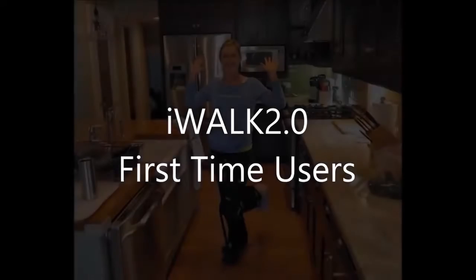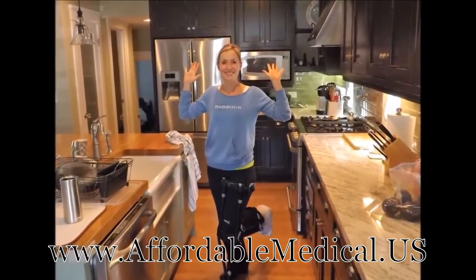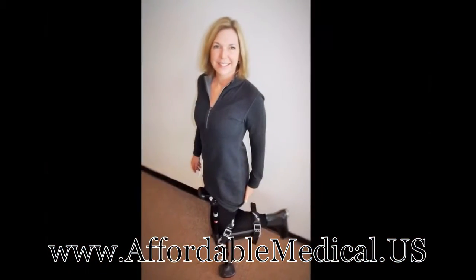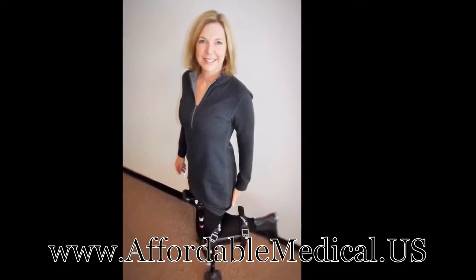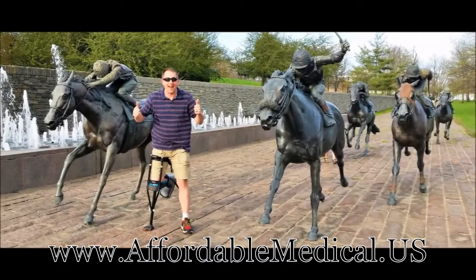You're about to see videos of people using the iWALK 2.0 for their very first time. They're not actors — these are real people with real injuries just like you. One thing they all have in common is that they followed our instructions before they got started, and that's what we want you to do too.